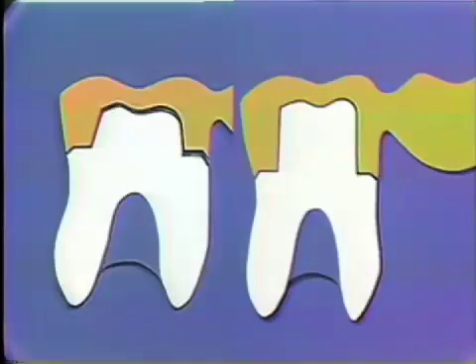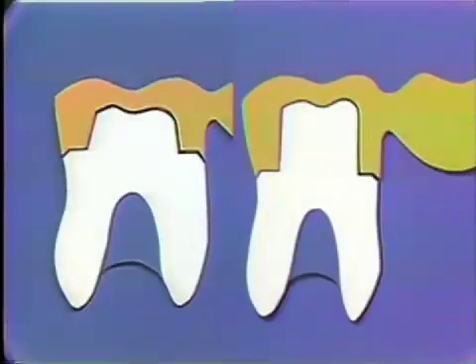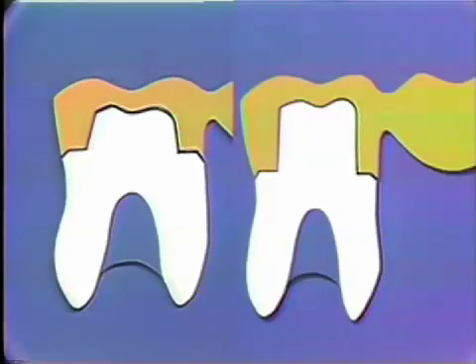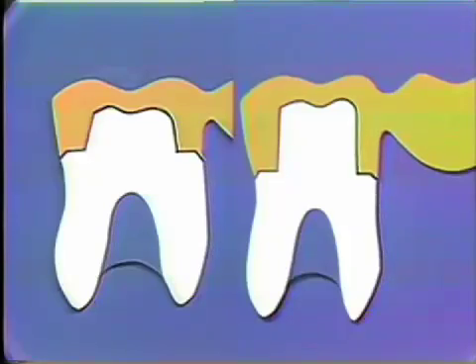In this particular situation, we might be looking at a cross-section through a complete crown preparation. Exactly the same thing would apply, of course, to the three-quarter crown, to an MOD protective cusp. It's important, therefore, in making these preparations to watch these particular points.